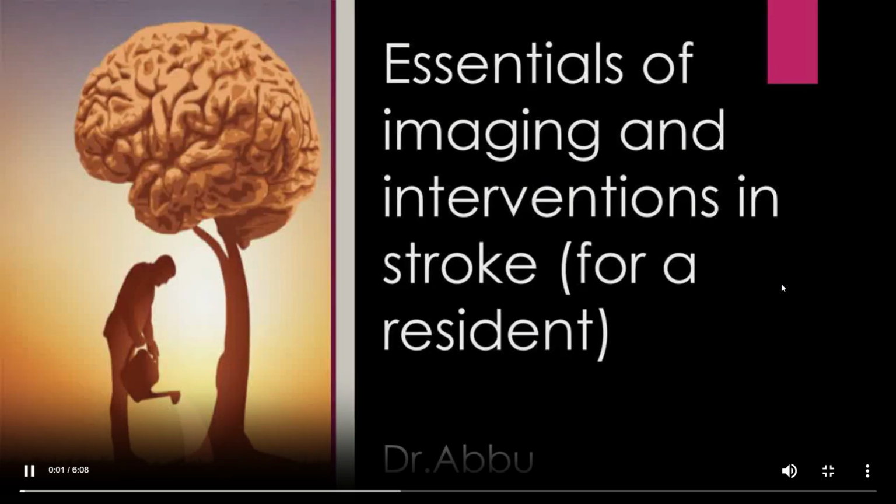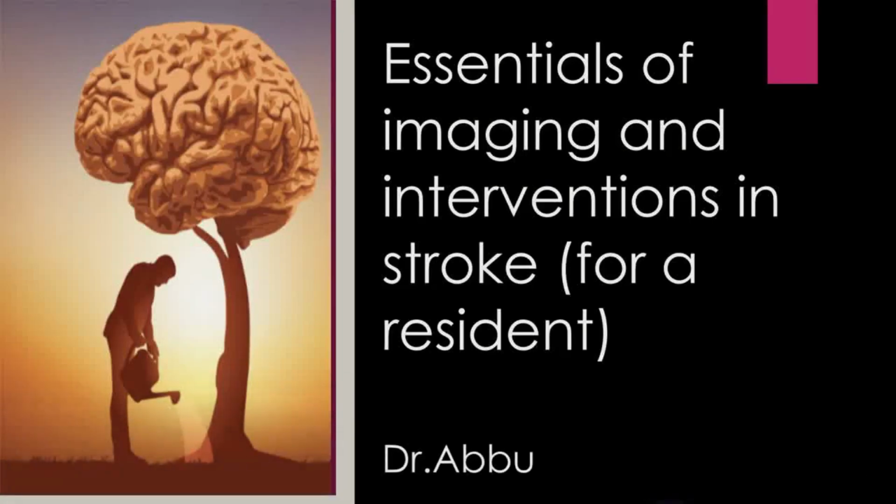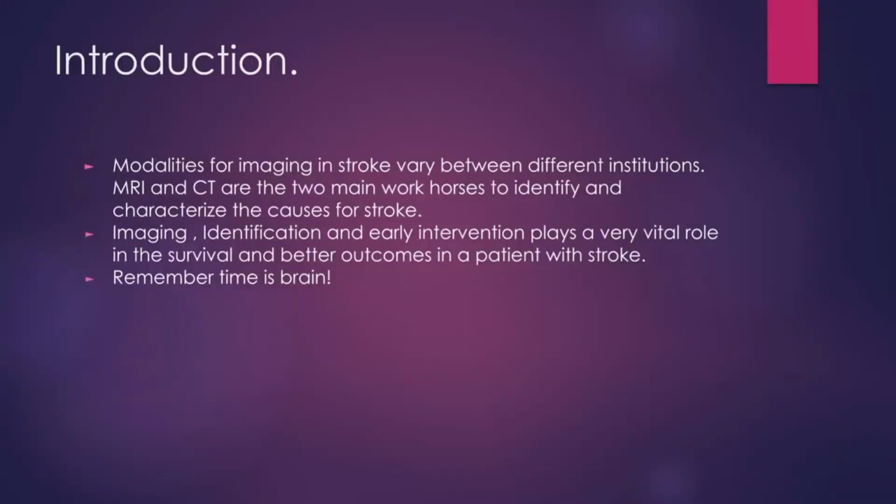Hello guys, let's discuss a few essentials on stroke imaging. I'm the AI voice speaking on behalf of Dr. Abu. Modalities for imaging in stroke vary between different institutions.